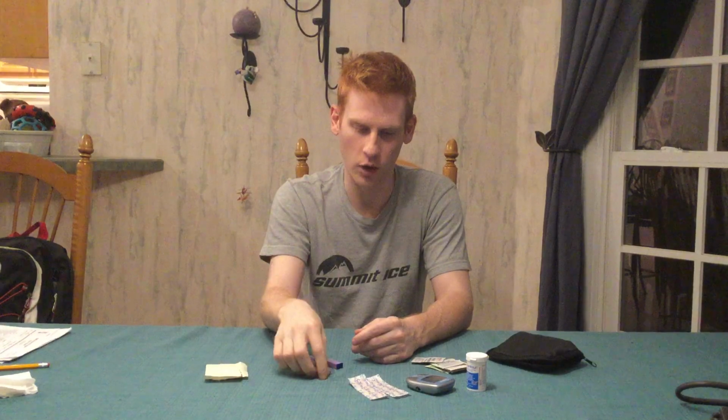So that's pretty good. You want alcohol pads to clean off the finger. These are needle sticks, and so you want to minimize risk of infection. So alcohol pads, Band-Aids for afterwards, and then lancets. Every glucometer has different styles of lancet. Some you just pull the thing straight off. Some you have to twist to prime. Just know where you work. And then of course gauze.